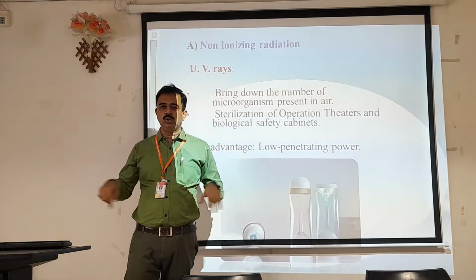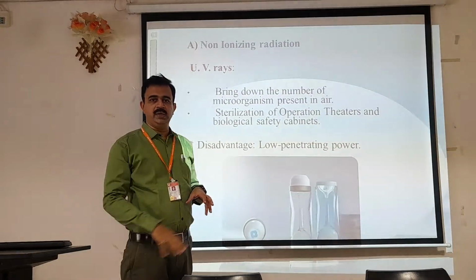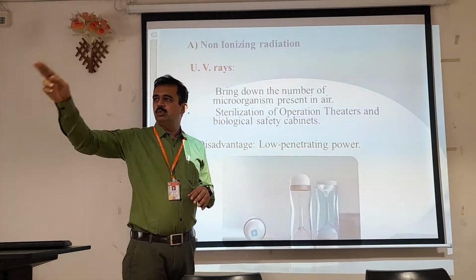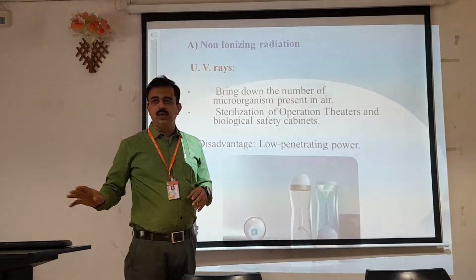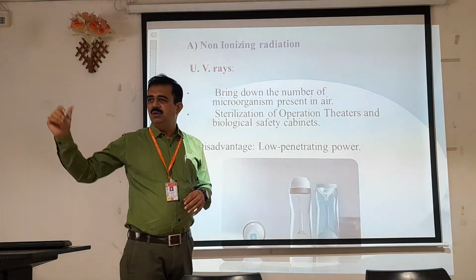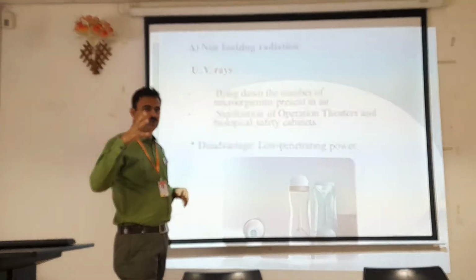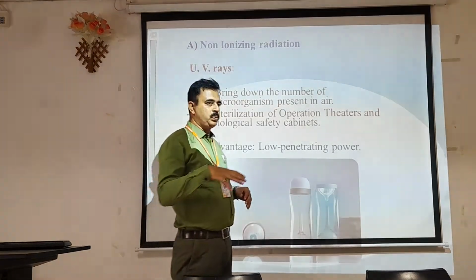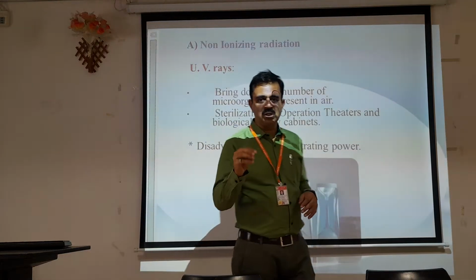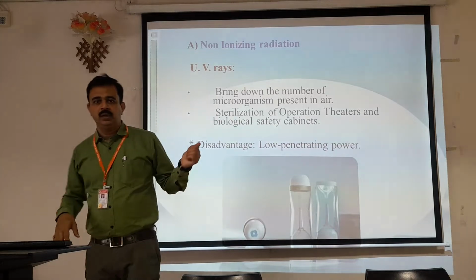For example, if this is a room and we want to sterilize the air flora inside here, what are we going to do? We are going to fix certain UV lights over here. Nobody will be in the room, we will get out of this room, and when we start the switch, the UV lights are exposed and the air microflora present inside this room will be killed because of the UV rays.